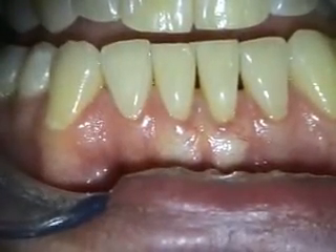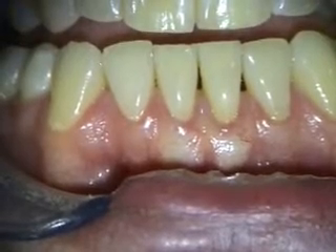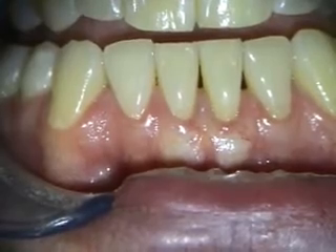This is about the two-and-a-half month healing of the gingival grafting, or the alloderm grafting, on the 24-25 area, and everything looks really good.